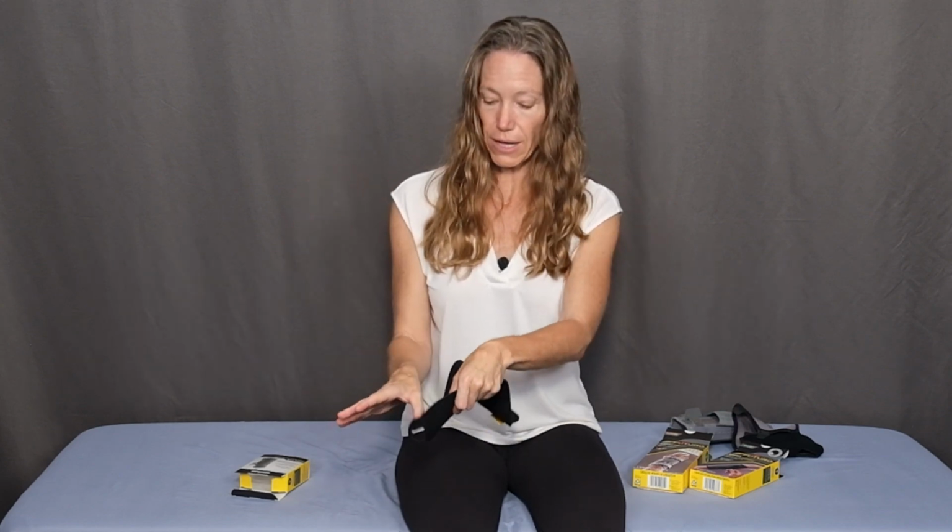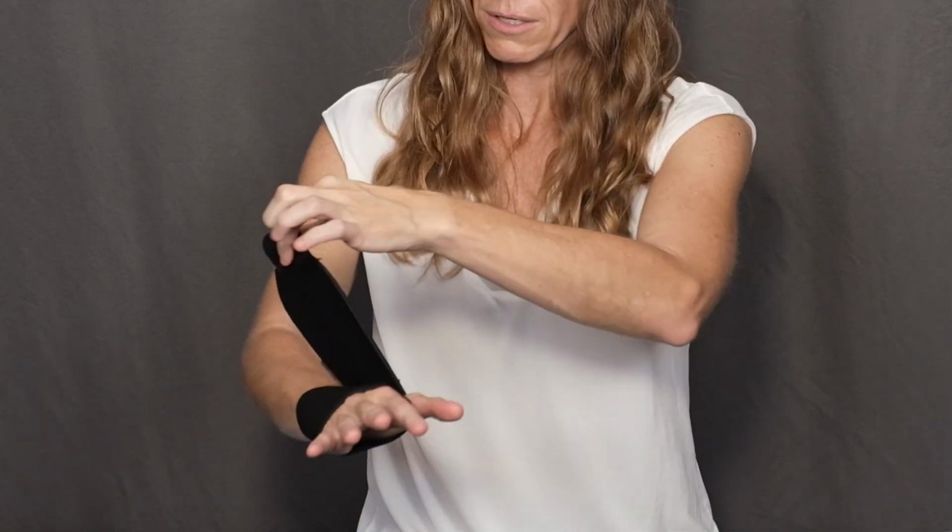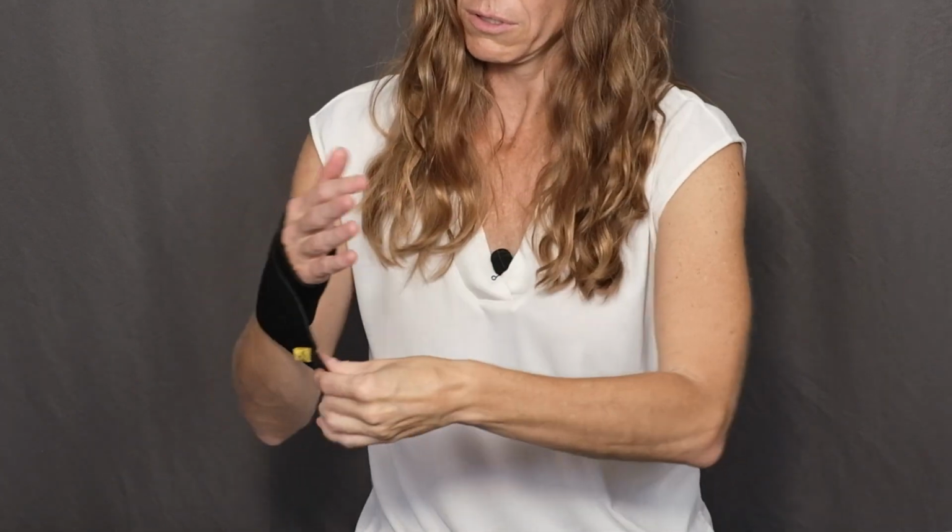So if I want to put it on my right hand, I'll put my thumb through this loop. And I'm going to wrap it from the back first. So I'll wrap it across the back of my hand, pulling so that it's snug but not too tight, and then wrap across the base of my wrist and continue wrapping until I Velcro it right through the front there.